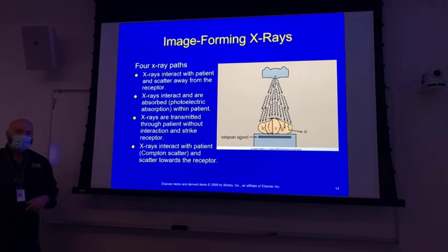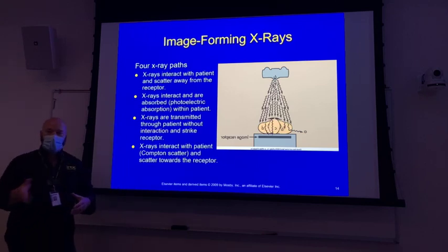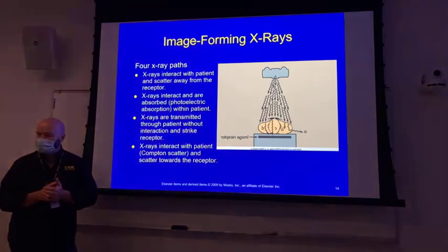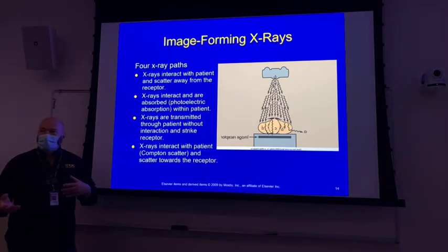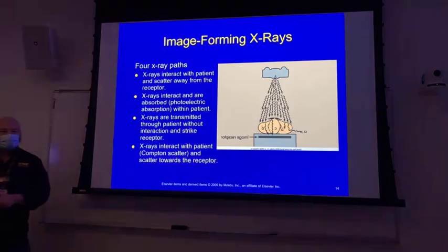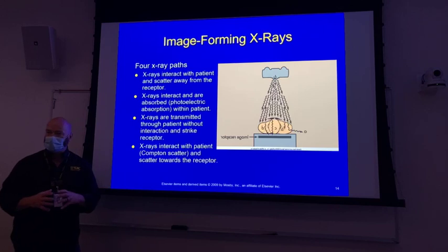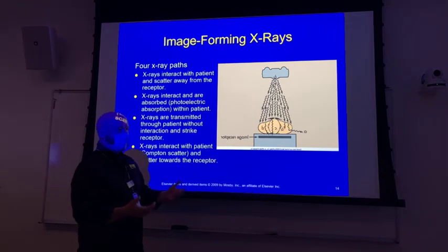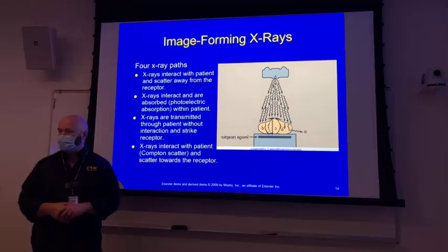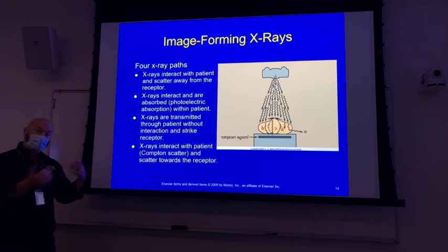But in reality, what can happen is a single photon can enter the patient's body, and it can bounce around off of a few different atoms before it becomes a photoelectric event. So in that bouncing around, you may have some things going on there as well. Okay, so if it knocks out an inner shell electron from one of your patient's atoms inside of the patient. It knocks out that inner shell electron. Is that a normal condition for that atom to be in? Just like in the target, no, it's not. It's not a normal condition, so it ejected that electron.